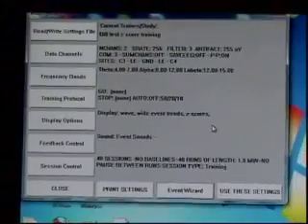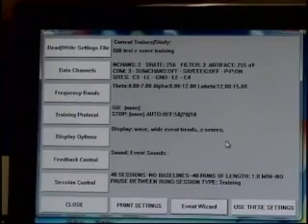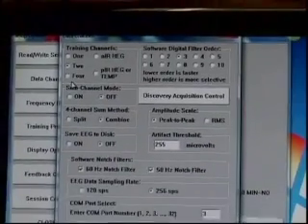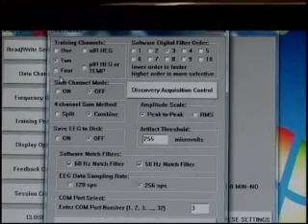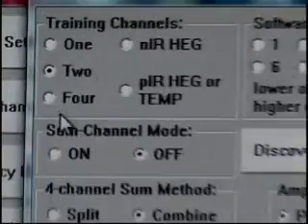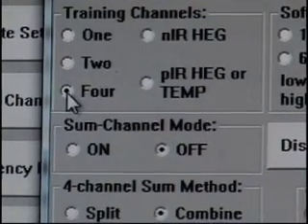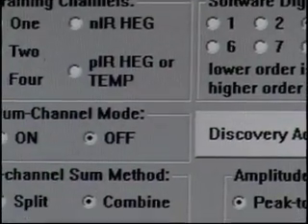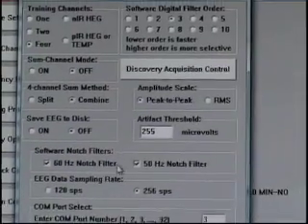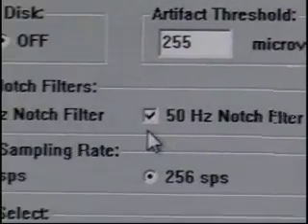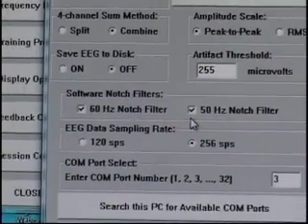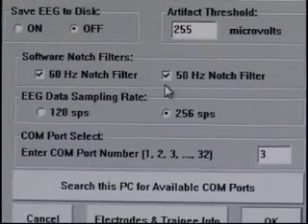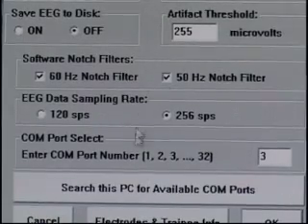As we go to Viewer Change Settings, there are several different changes we're going to want to make on this particular protocol. Our first step is Data Channels. When we go to Data Channels, our first option is the number of channels we plan to train. With z-score training, the most common number is 4, and that's what we're going to use for today's exercise. As we go through some of the other options, they're all fine with their defaults. I'm going to leave the notch filters on simply because we do not have a client hooked up and we're going to be running simulation, but if you're actually training a client, make sure these are off so you know you have a good signal.